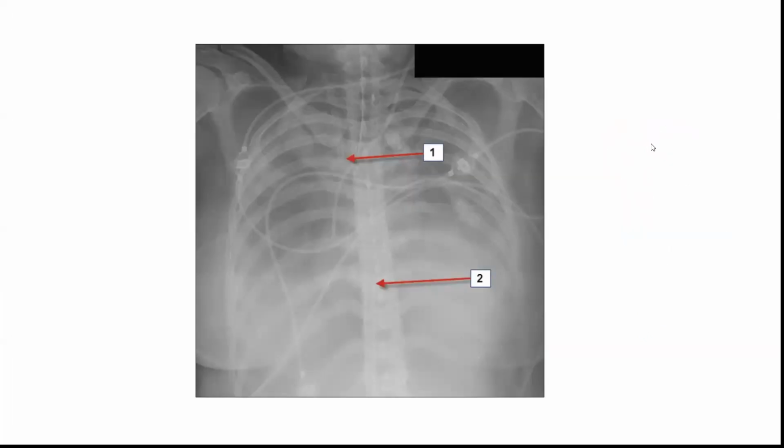And normally says how we'll look on x-ray. You see the distance between the femoral catheter and the IJ catheter. And we'll have a picture later. So I'll show you where you can see how recirculation can happen if that changes.